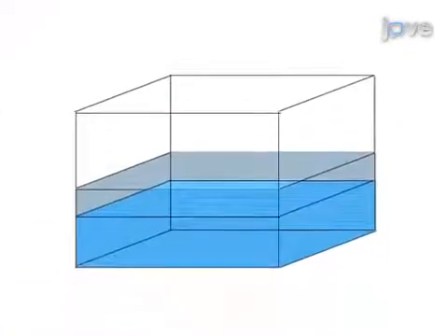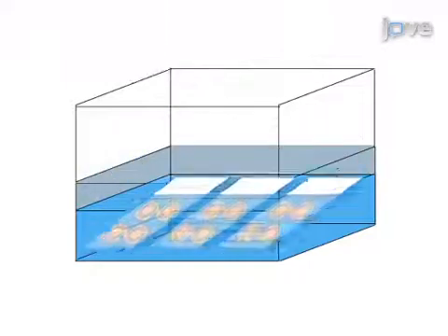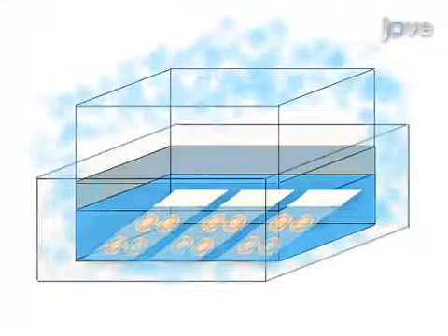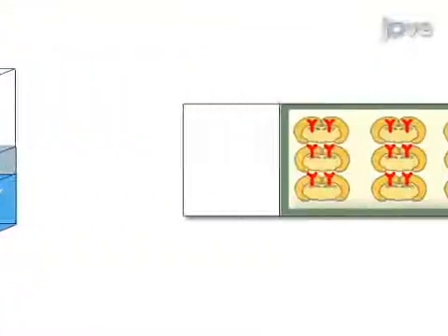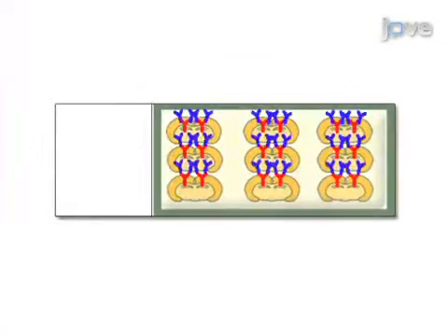The second step is to boil the slides of tissue in chaotropic treatment and to allow sufficient time for cooling. Next, stain the tissue overnight with primary antibodies.